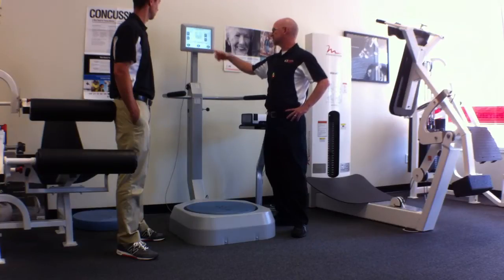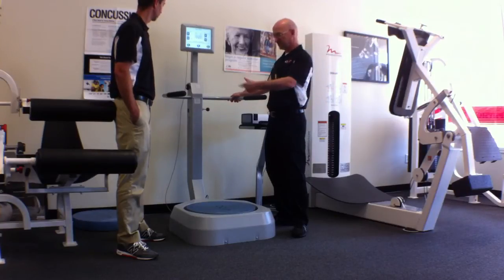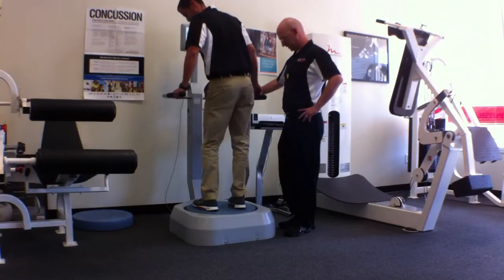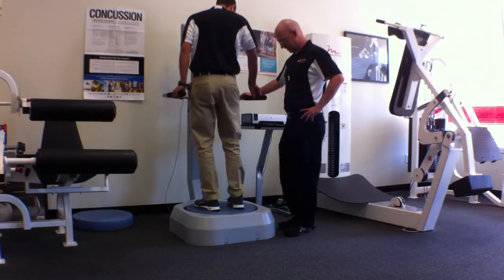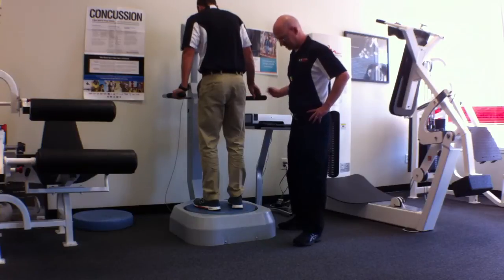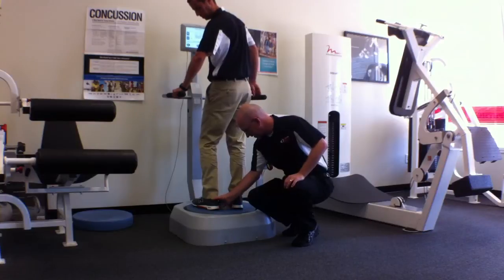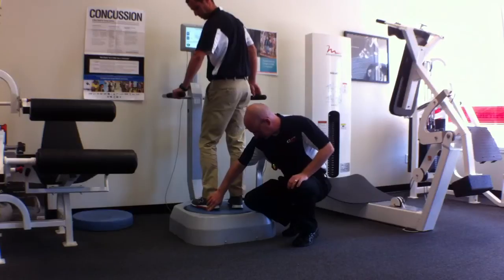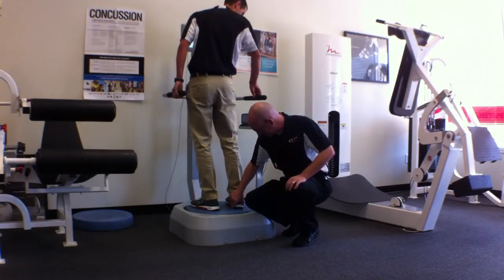When we go to next, it's going to give us our numbers for our foot placement, and we're going to go ahead and track that. Peter's going to step up on the balance system, and we're going to have a foot angle of 10. He's going to put his feet parallel with the line that says 10 degrees, and then he's going to put his heel on a D6. So he's going to move a little bit forward. The heel is at the letter, a little bit back, a little bit back. Oh, sorry, right there, and then 16 here for the D.